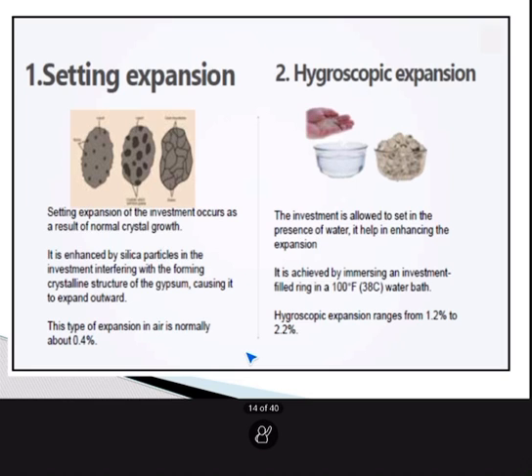Another is your hygroscopic expansion. This investment is allowed to set in the presence of water, and it helps in enhancing the expansion. It is achieved by immersing your investment filled ring in a 100 degree Fahrenheit water bath. Once you have filled your investment ring, you have to put that investment ring in the water bath with the temperature of 100 degree Fahrenheit. And this hygroscopic expansion ranges from 1.2 to 2.2%.